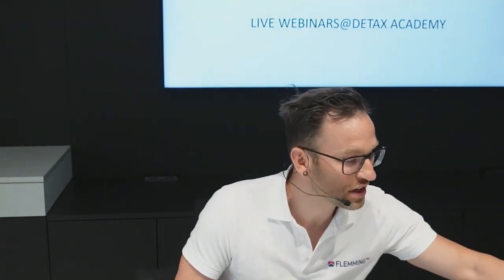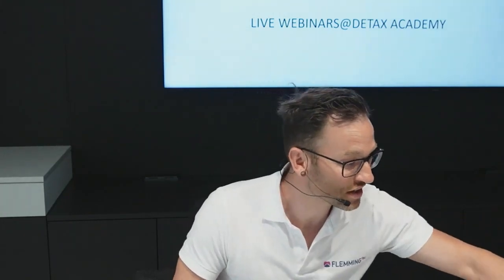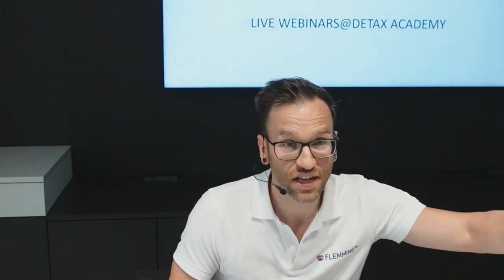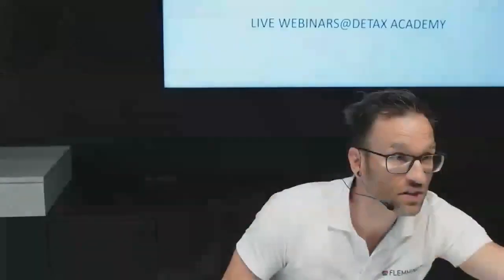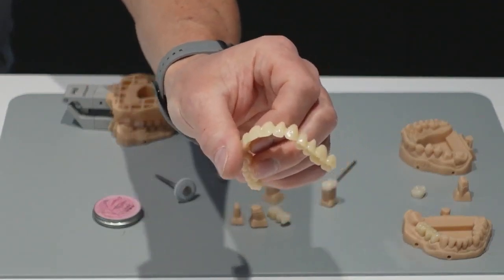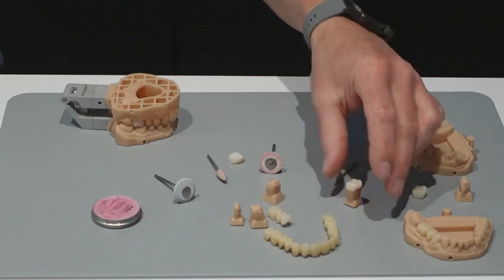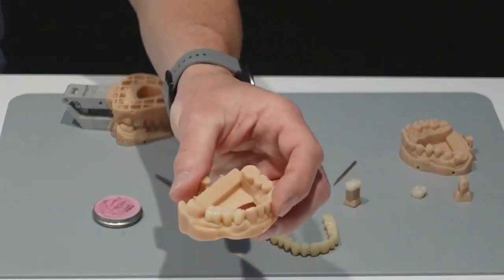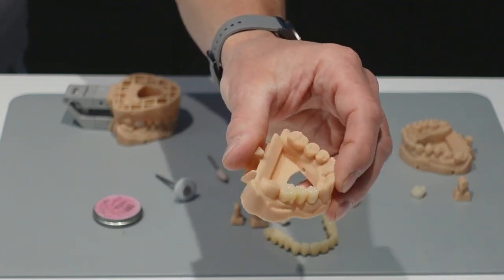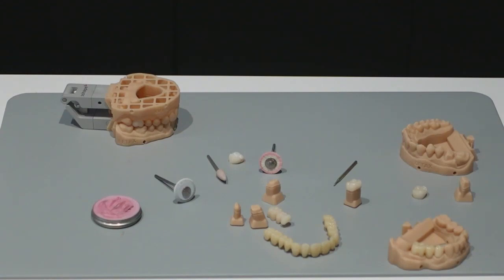So we can not only create a crown, we can create bridges with this material, yes, and of course denture tooth bows. You are absolutely right. This is also for denture teeth, for permanent denture teeth. You can use the material, and on how to prepare, we will give you a handout or a short video on how you can model it, and you can download it later. Or we give you the information on the platform.